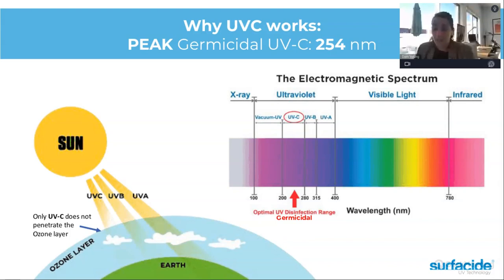I see another question about using a hypochlorous acid sprayer to disinfect each operatory. There is no concern using UV light after that. There is none. The nice thing about UV is there's no interaction between chemicals and the light wavelength. It really is just between pathogens. The nice thing is that there's no waiting period after UV. So if you want to do your spray and then UV at the same time, you are welcome to do that.